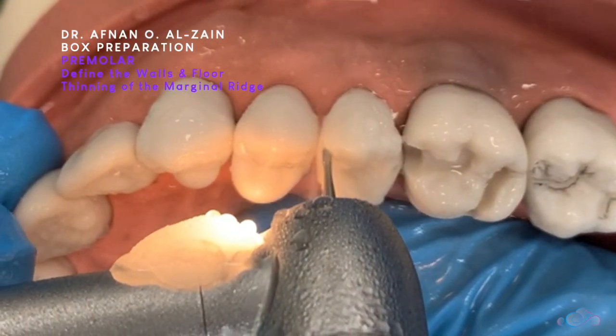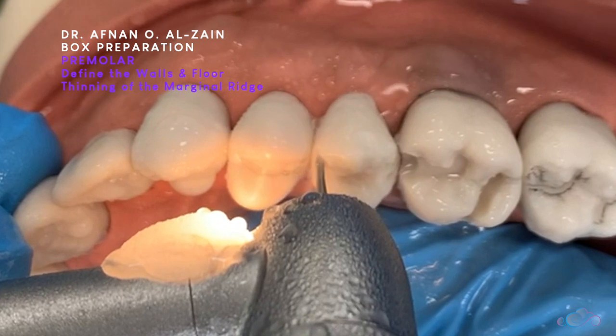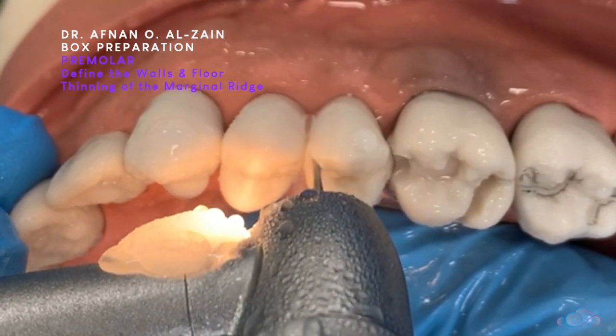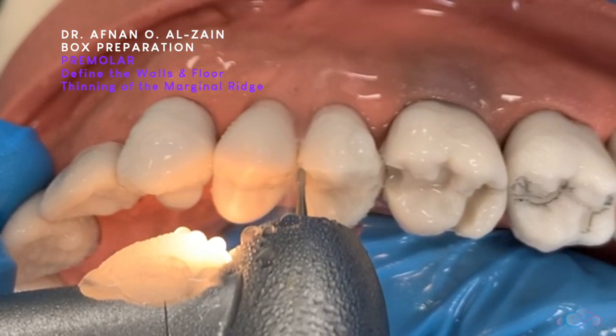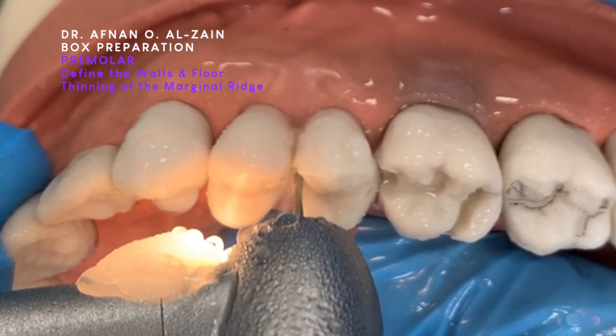In this video, we will cut the marginal ridge with the bur, not using the hand instruments. You have to be very careful and fix the wall so you don't injure the neighboring tooth.